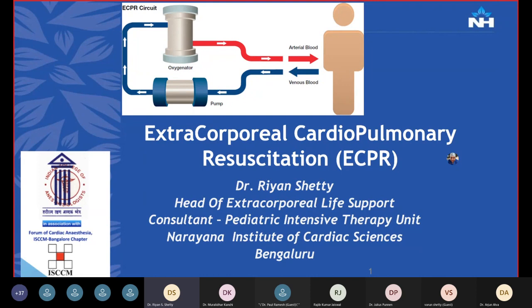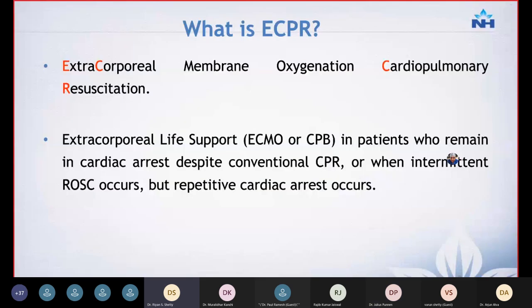So I'm going to talk mainly about extracorporeal cardiopulmonary resuscitation, or what's called ECPR. I'm not going to elaborate on what kind of ECMO we use for it. I'm going to talk about what the concept is and how you implement it. Where are we in the ECPR program in Narayana?